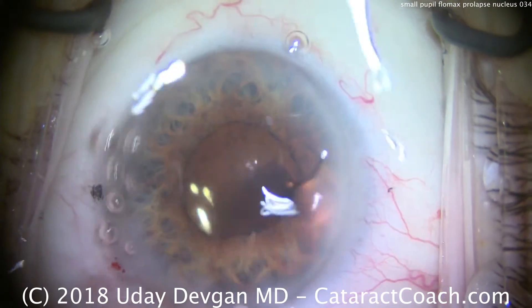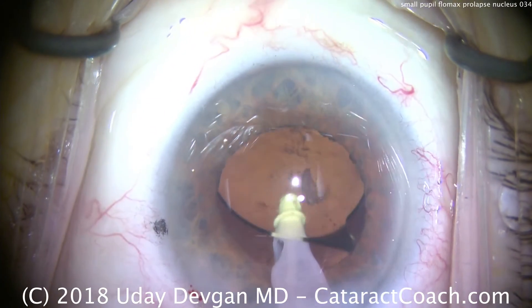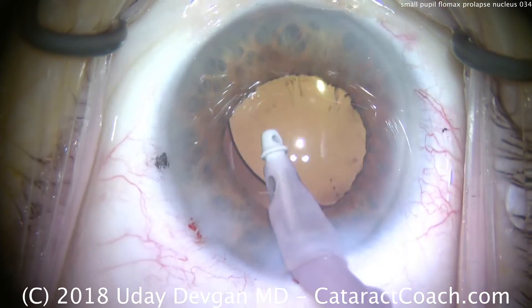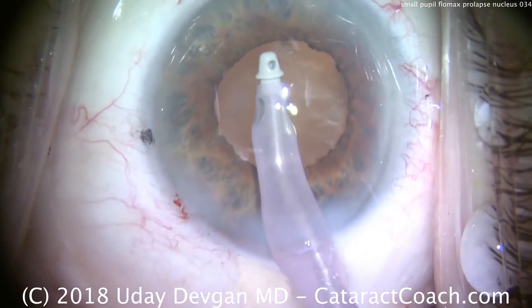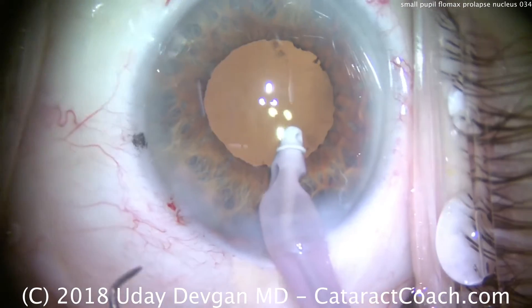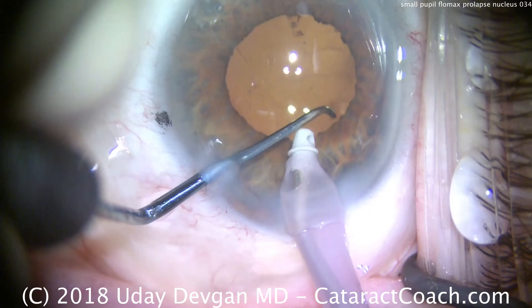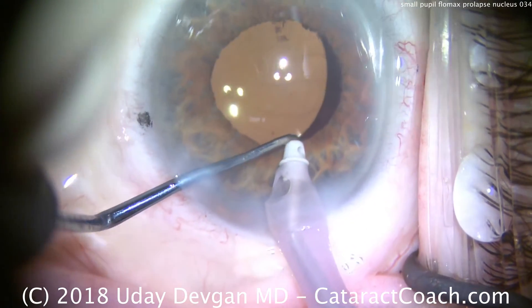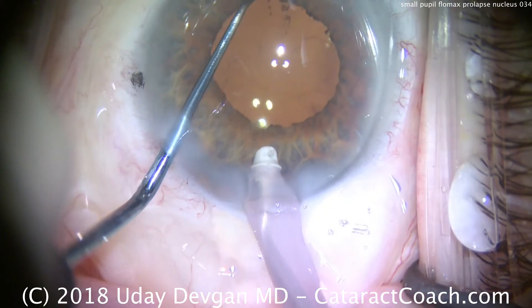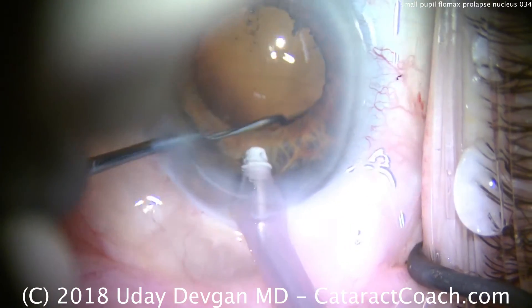So now let's take the I/A probe in the eye and take out that cortex that we saw. Go under the IOL and remove the viscoelastic. You can also see the toric marks on the IOL. Remove the remaining viscoelastic and clean up the anterior chamber as well. That looks beautiful. With the chopper in the eye, the I/A probe is on position one, and we're going to rotate the lens to line up our toric marks. In this patient, it's approximately the 180-degree meridian.